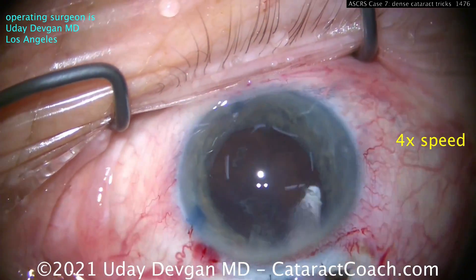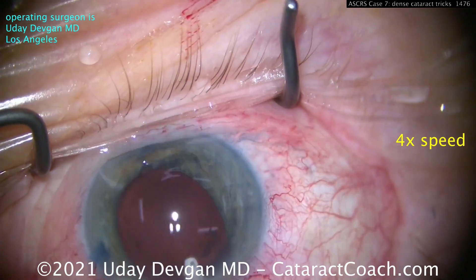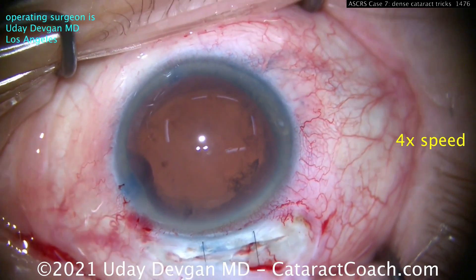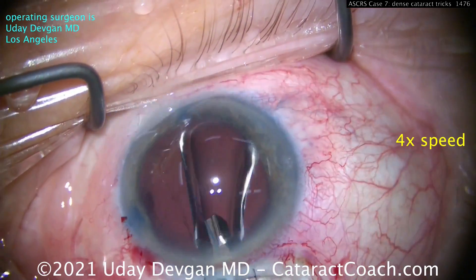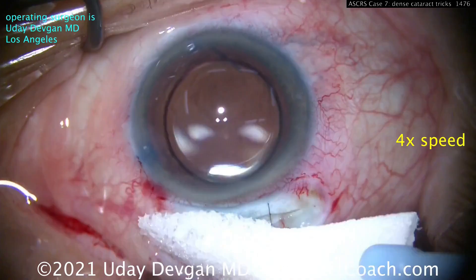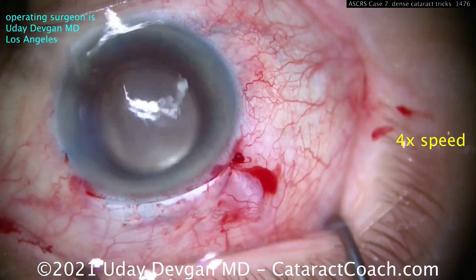You can see a little bit of iris prolapse here, so bimanual cortex removal helps prevent that. Then we'll get the lens in the eye — you can put a larger non-foldable lens like a PMMA lens, but here we only have foldable lenses, so we'll inject it. This is actually a very low-power lens for a high myope: a two-diopter lens for someone who's very myopic with a 30mm axial length. And you'll see at the end — that's just a beautiful result. So please, I implore you: learn MSICS.